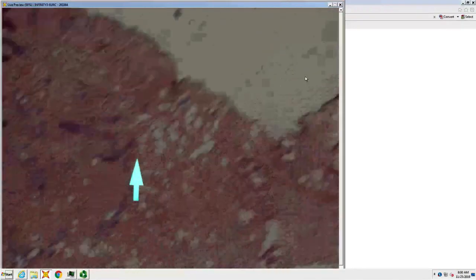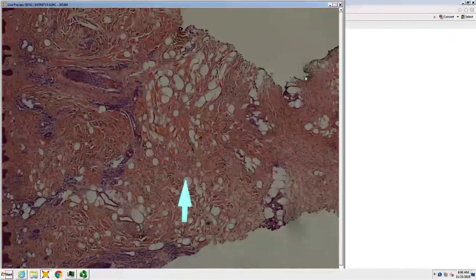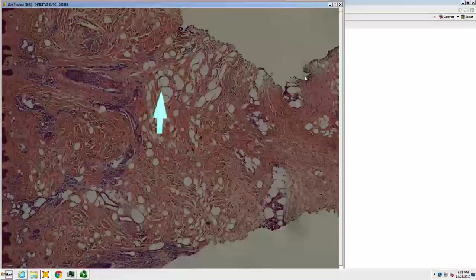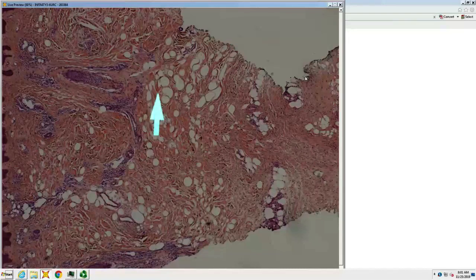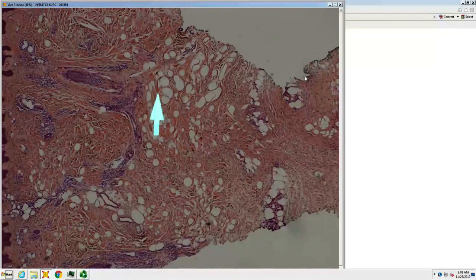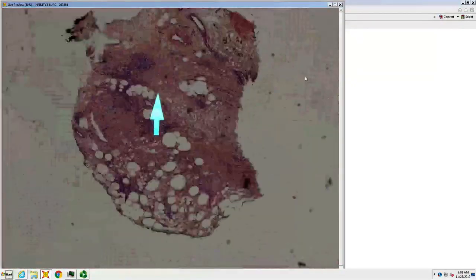Got a bunch of biopsy. What are all these circles? Fat. Fat up in the dermis? Or could it be xylocaine from the injection? Definitely could be that. And if it's xylocaine from the injection, what does it tell you about the condition? It was sclerotic, right? You had to pump the xylocaine in there because it was sclerotic. So when you see those round circles, it tells you this was something sclerotic. And then we're down in the fat.